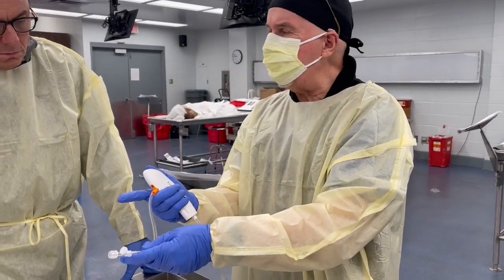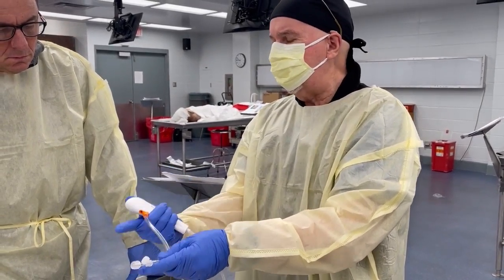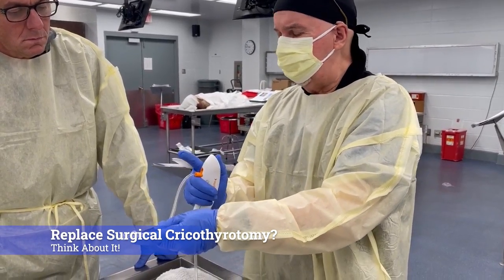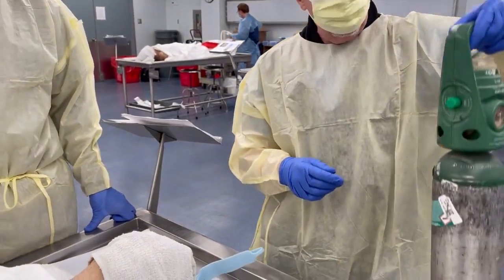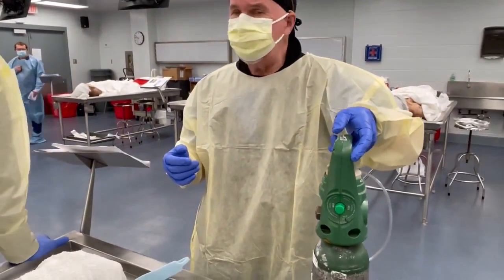It also has the option for passive expiration. You let your finger up and keep your thumb on the top port. There are two ports — the top port is for sucking air out, the bottom port is for passive expiration. I also have oxygen cranked up to about 15 liters.